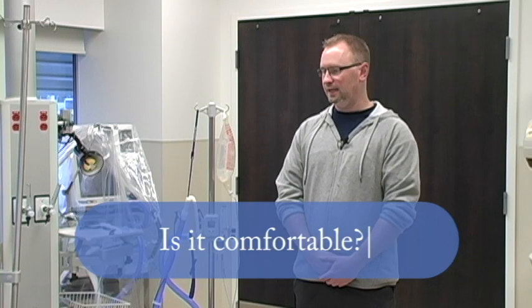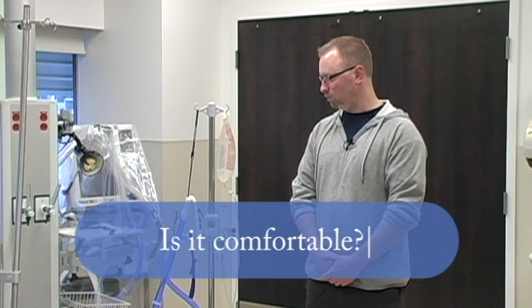The next question then, obviously, if you're using 60 liters a minute, is it comfortable for the patient? It actually is, for two reasons. One, the gas is heated and humidified, as opposed to the gas that we deliver out of the wall of the hospital. The oxygen that comes out of the wall is typically about 18 degrees and bone dry, no moisture in it whatsoever. So it can be quite uncomfortable at higher flow rates to the patient. So if we heat it to body temperature, 37 degrees, and 100% humidify it, then it's more comfortable for the patient. So you don't really notice as much.